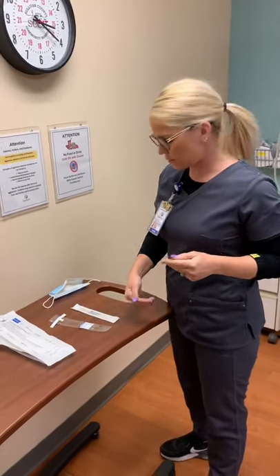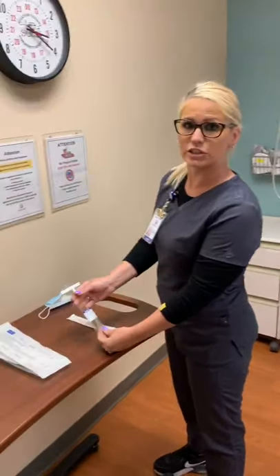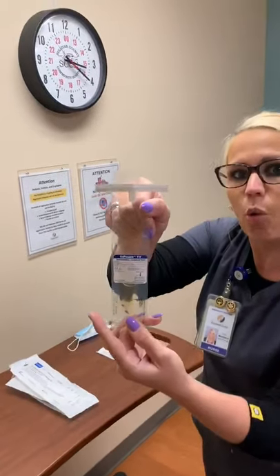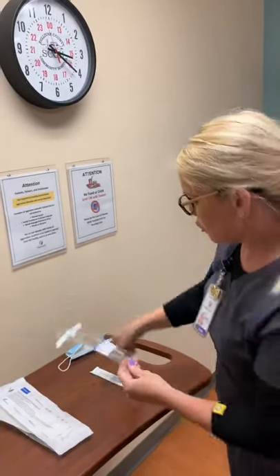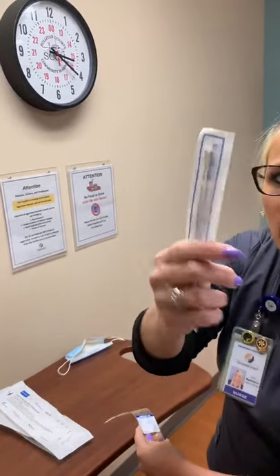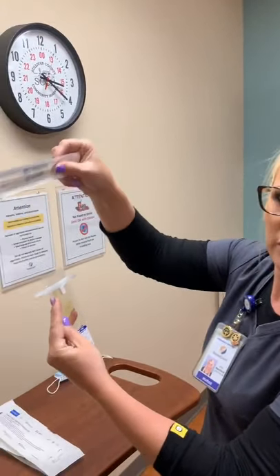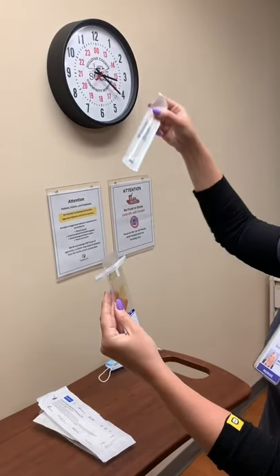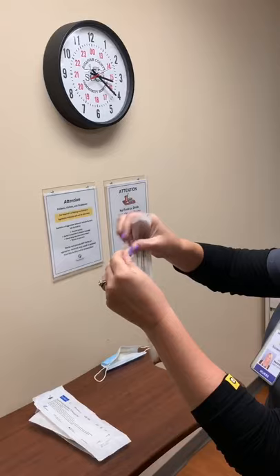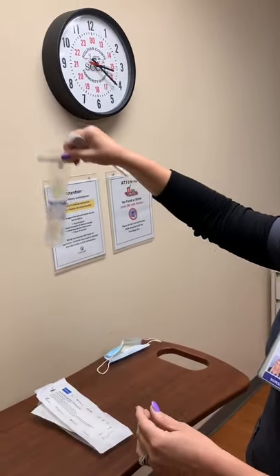We have two different types of swabs we can do for pelvic exams, over here in this cabinet. You can call the lab if you need additional supplies. The first one is a wet prep for testing trichomonas and white blood cells. You use these swabs here — regular cotton tip applicators. You don't have to use both of them; just one is fine. The doctor will put it in and swab the cervix and vaginal region, then you dip it in, swirl it around, and remove it before closing the package, sending just the solution down to the lab.